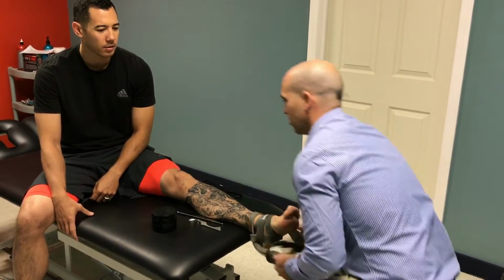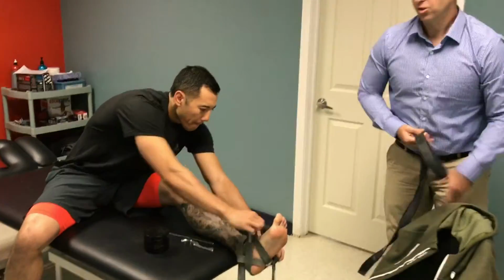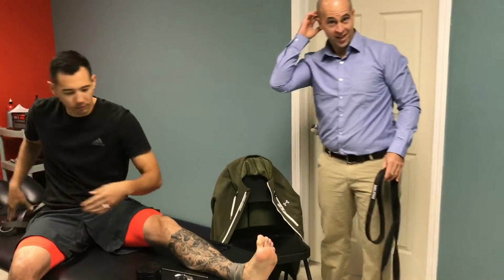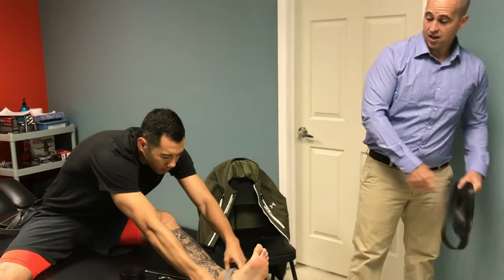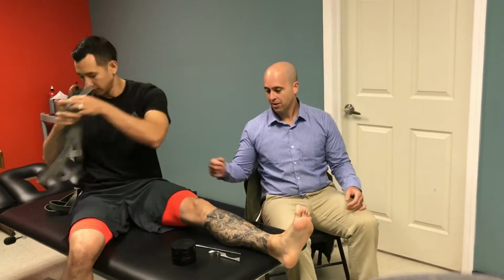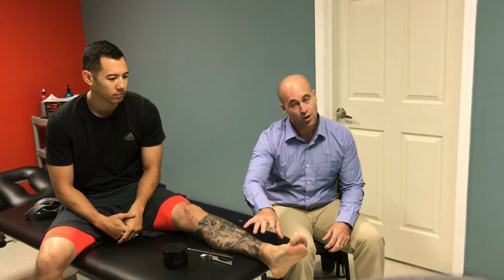All right. I'm going to take this off for me. After we get those muscles firing, we just did some light exercise to reinforce those muscle patterns. And then what we did was needle around the swelling and around the muscles.